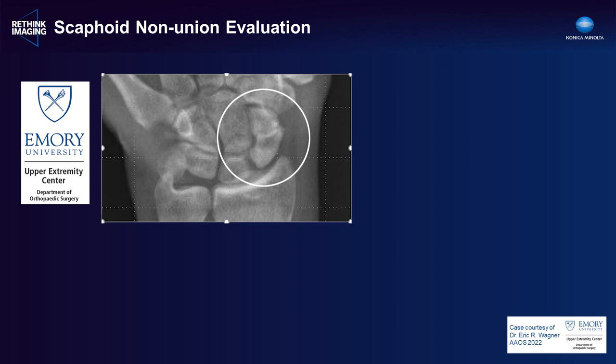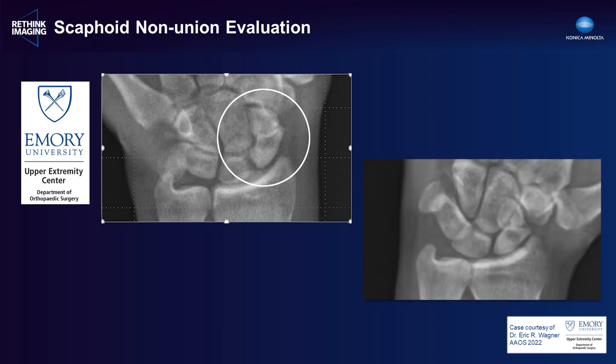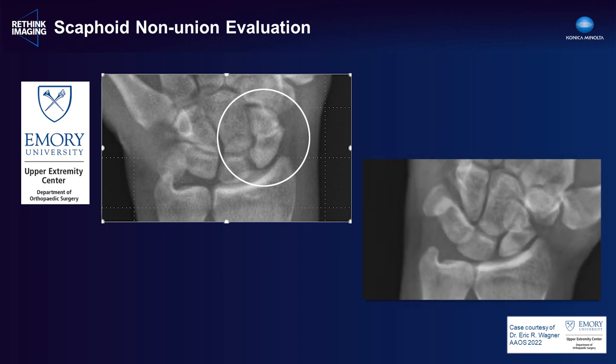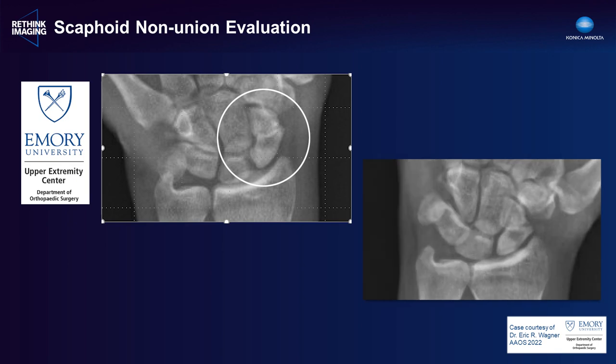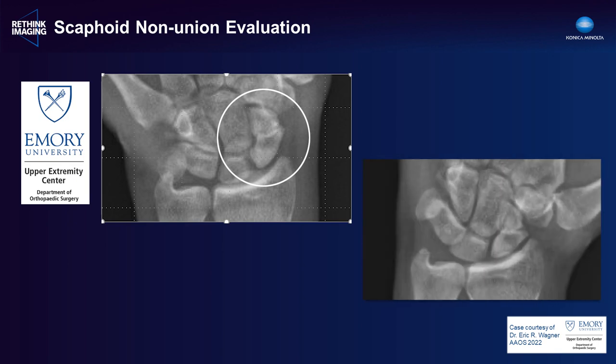In a wrist case of scaphoid nonunion, the static image presents a challenging diagnosis. The scaphoid bone is clearly fractured but it's difficult to assess if it's displaced—there's not a definitive gap between the two components and it's hard to tell if the distal pole has shifted relative to the proximal pole. However, in motion it's very easy to see that this is in fact a fully displaced fracture. DDR can therefore help with accurate, timely diagnosis and very efficient patient care.